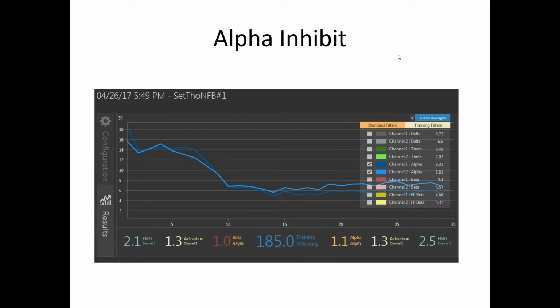Now, we're not looking at how much everything moves between 1 and 2 standard deviations because we're not just looking at Z-scores. We have a different approach. With Z-score, you're trying to constrain everything within a limit, and then you try to come up with an algorithm trying to second guess the brain about how much and what things should be constrained.